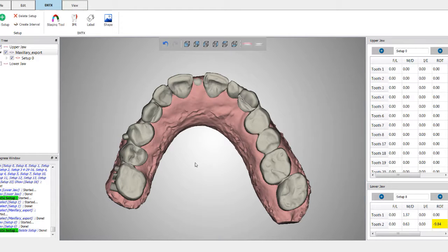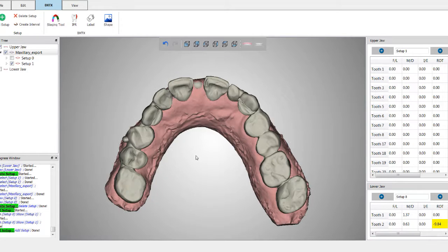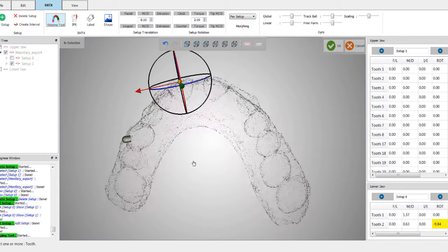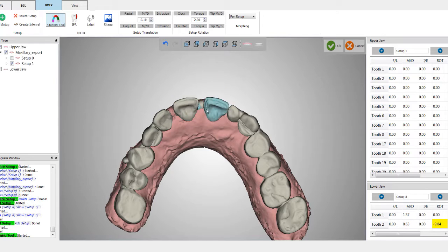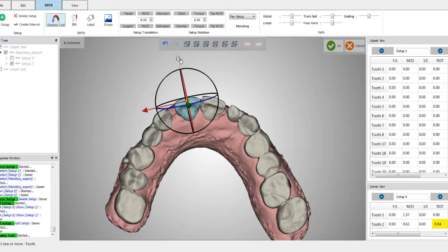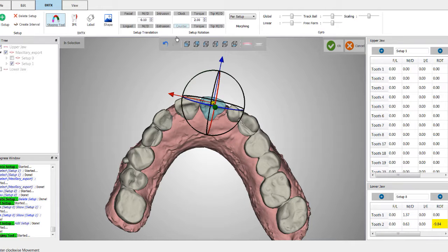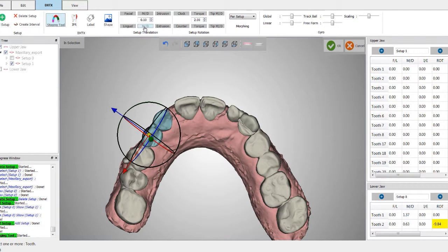As far as space closure, we are going to follow our same protocol with crowding, except actually just in reverse. So what I mean by that is, first we're going to click on Add Setup, Upper Jaw, and then we're going to click on the staging tool. We're going to close the diastema about halfway, and we're going to close this diastema here about halfway. I'm going to do just a little bit of counterclockwise tooth movement here, and then I'm going to take these two teeth here, and I'm just going to bring them mesial.